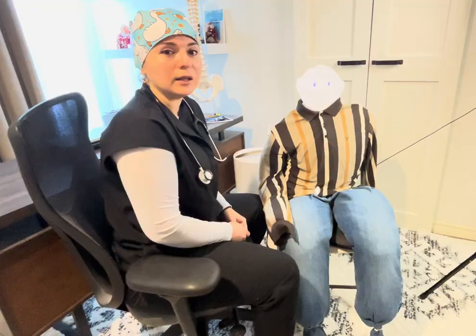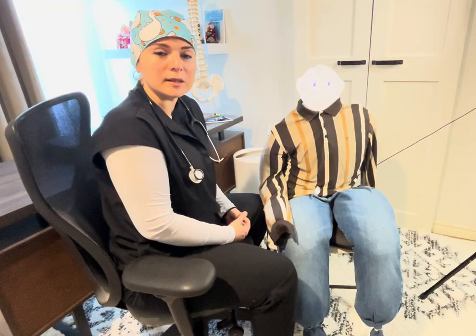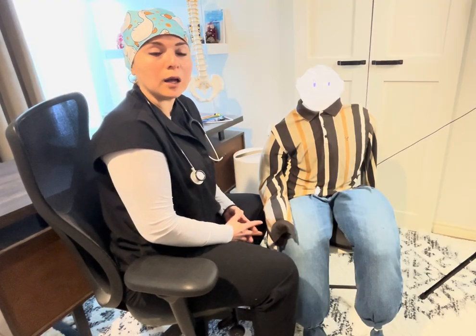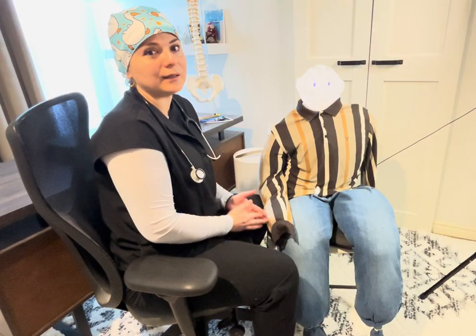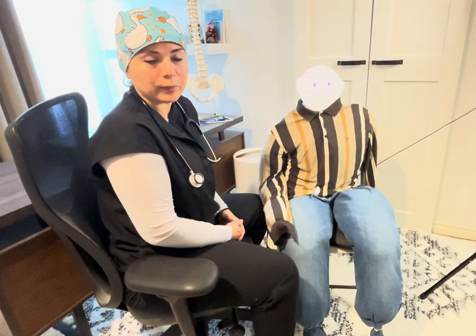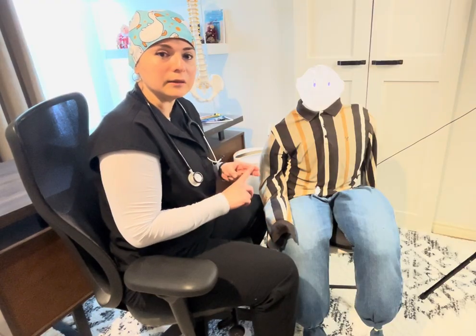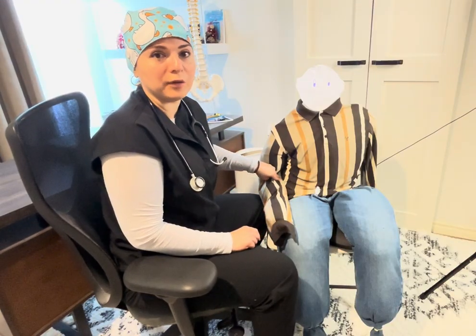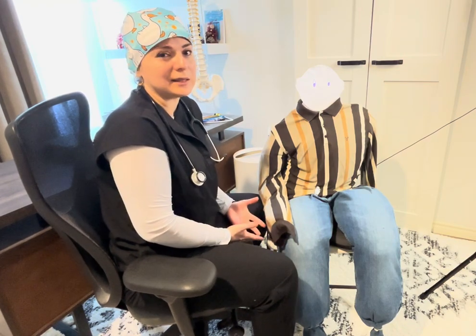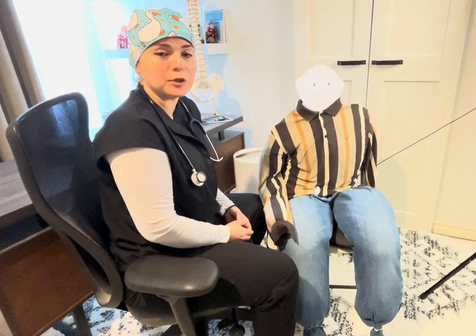When palpating, do not use your thumb because your thumb has its own strong radial pulse — you don't want to feel your own pulse instead of your patient's. Instead, use two fingers: the index finger and the middle finger, and palpate to find the pulse. Usually five to six seconds of palpation is sufficient to locate it.